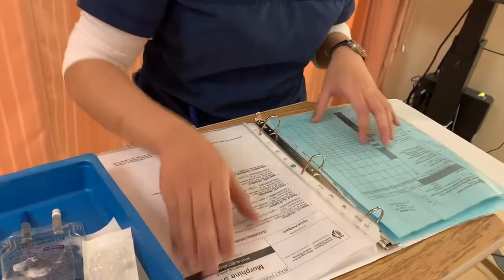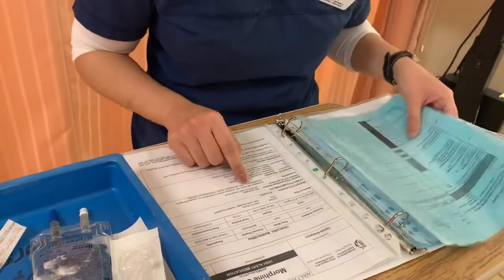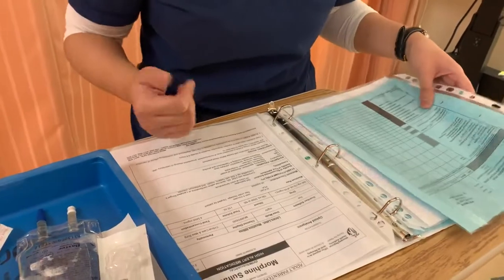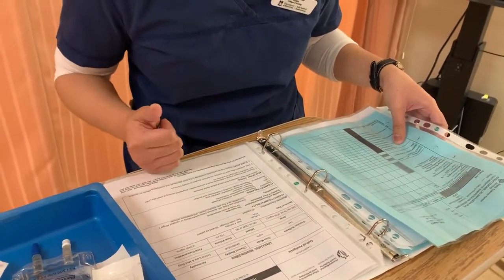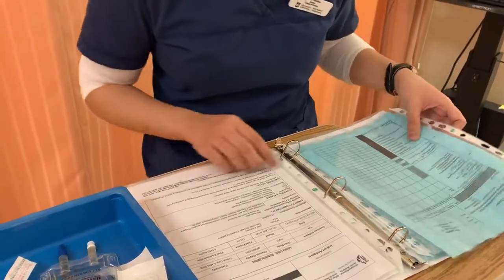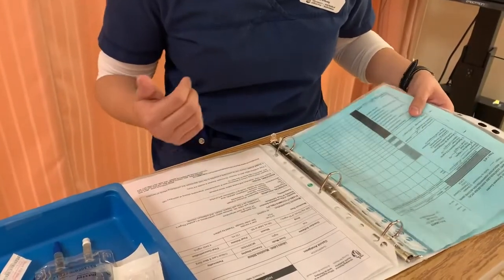So what we're going to take a look at now is the compatibility of this medication. It is compatible with normal saline, which we know is already running at the bedside as the carrier infusion. We also check the potential hazards such as respiratory depression, dizziness, nausea, and vomiting. And we're going to monitor the patient's pain relief for this as well. We're also going to check the stability for this one, which is 24 hours at room temperature.